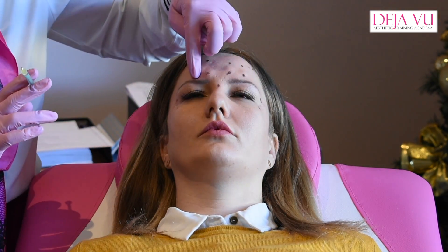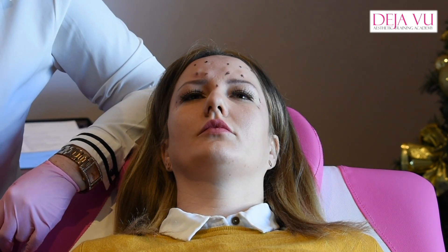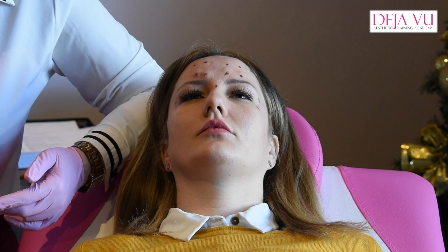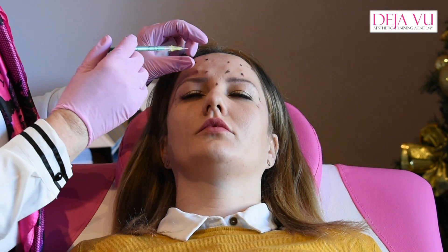I did the eyes first, and I do that because the needle's sharper. The advantage with these is that one 30-gauge needle is going to do all three areas, and it doesn't get blunt. When I first started training, we used insulin syringes and the needle does get blunt — insulin syringes are only made for one injection. So everyone's got their own preference, but I prefer to do it this way and I don't have to keep stopping either.